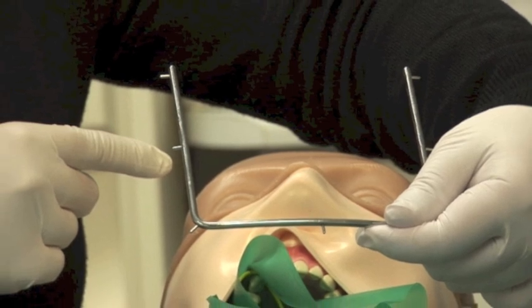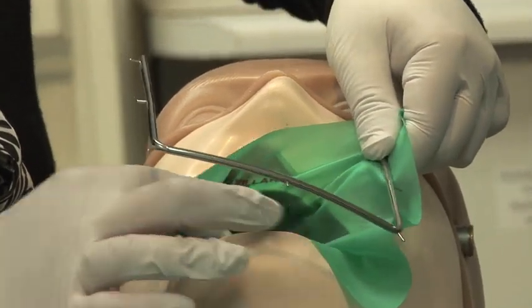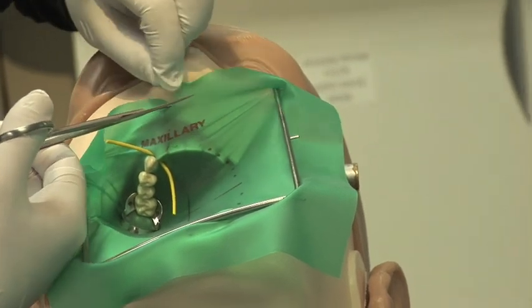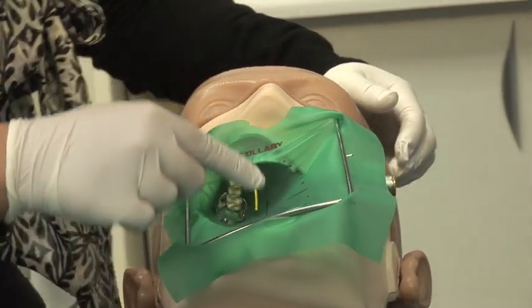Next, take the rubber dam frame. The frame has a curve and it should rest over the chin — the open end should point towards the upper jaw. Stretch the rubber dam around the spikes. If the rubber dam is covering the nose, cut the excess off so that the patient can breathe.